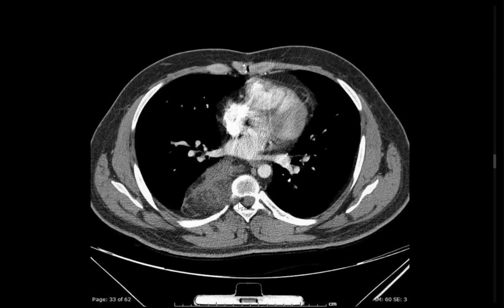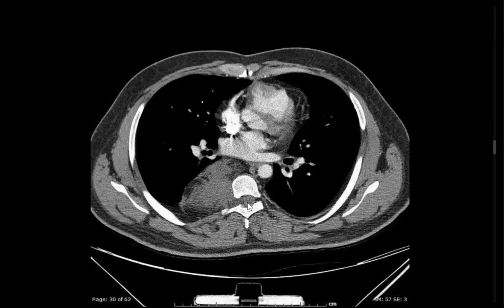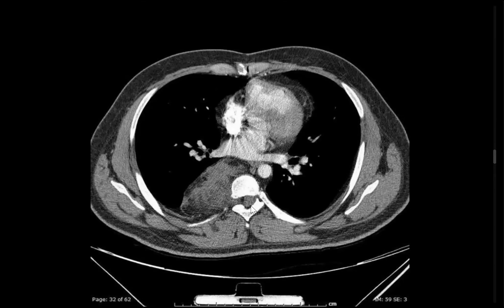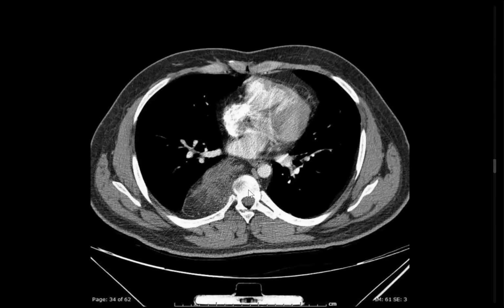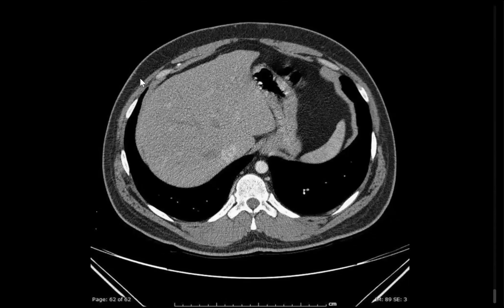An important point mentioned by Dr. Amir is the intraforaminal extension and compression on the thoracic dorsal cord, which necessitates an MRI study to look for any cord myelomalacia affection by this compression. And of course, convey the findings to the referring clinician.